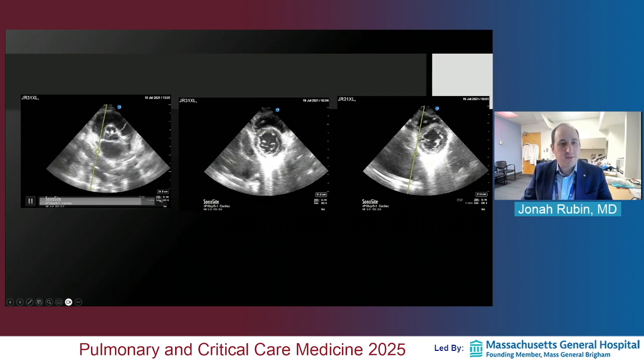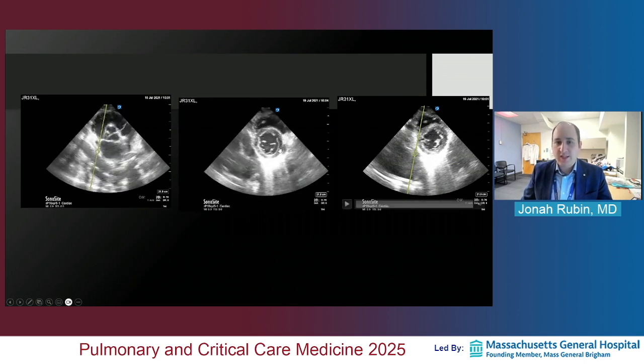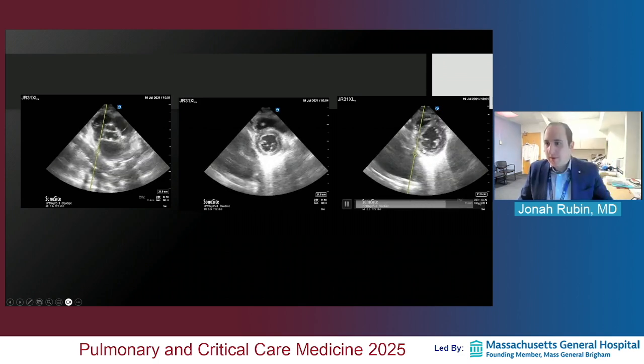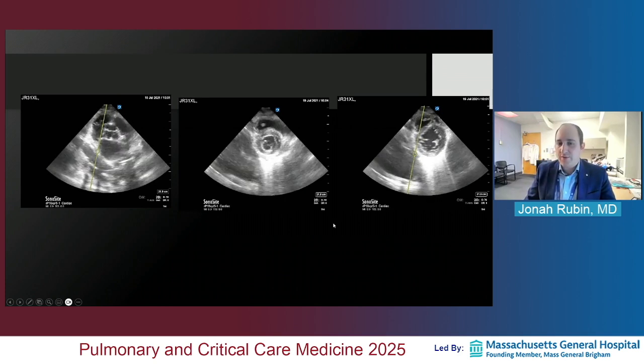But here you have the parasternal short at the aortic valve level. The aortic valve, this is a little bit beyond basic echo, isn't opening so robustly. But overall, this looks normal. Here too, you've got symmetric circular LV function. It's functioning pretty well. This is at the mitral valve level. You go to the papillary muscle level and same thing. The muscle's thickening. The RV doesn't look big. It's coming in symmetrically. So far, everything is looking quite good.